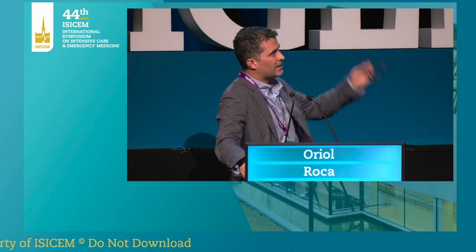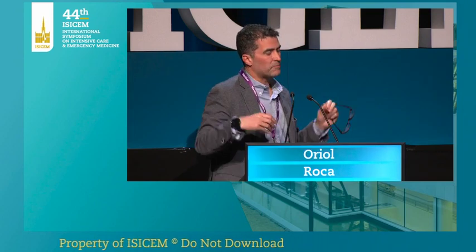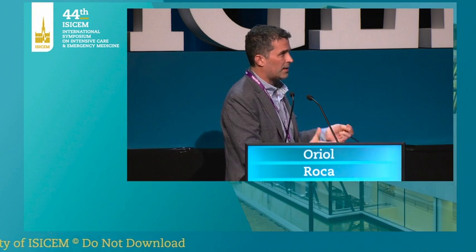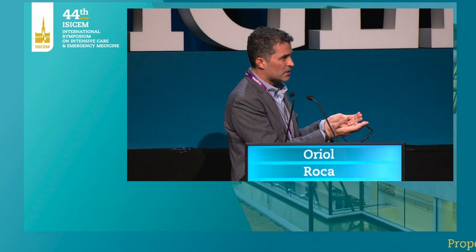Yeah, behind that nice plots that I show you at the end, which we call the representative patient, exactly, usually, there is a lot of work behind filtering the signal. There are a lot of hours of engineers working on how to filter the signal. Now we have improved the technique on how we acquire the data and how we process and envelope the data to get these plots. And then our aim is, because of course there is variability in between patients, we need to have enough patients to be sure that the behavior of 70% or 60% is the one that I have shown you.